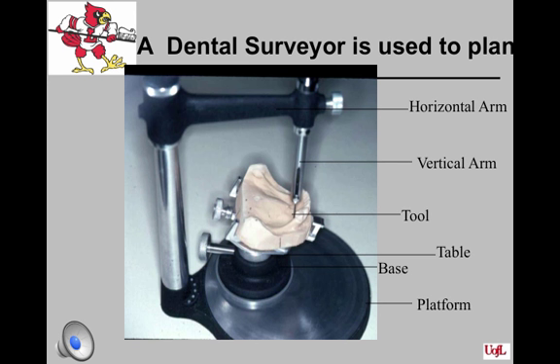To properly design an RPD, the dentist, not the laboratory technician, must consider the path along which the prosthesis will be inserted and removed from its terminal seated position. Upon insertion, the clasp arms will contact the axial surfaces of the abutments. With continued seating, the retentive arms will flex as they pass over the height of contour of the abutments.